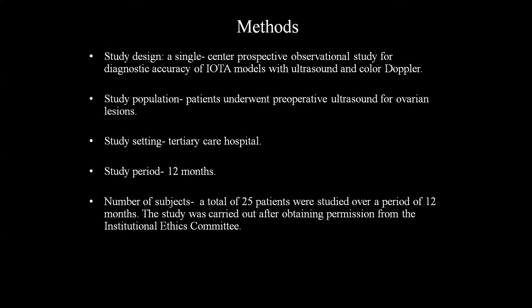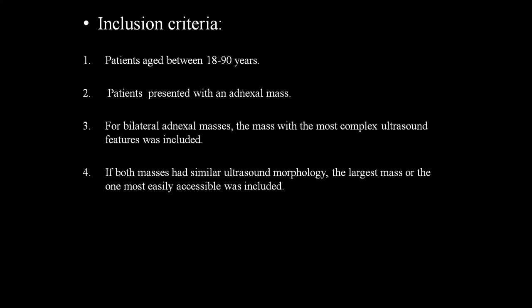The study method: the study design was a single-center prospective observational study for diagnostic accuracy of the IOTA model with ultrasound and color Doppler. The population: patients who underwent preoperative ultrasound for ovarian lesion. Study setting: tertiary care hospital. Period: 12 months. Number of patients: 25, which were studied over a period of 12 months.